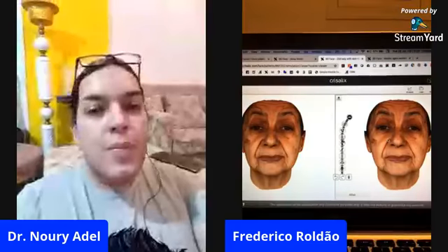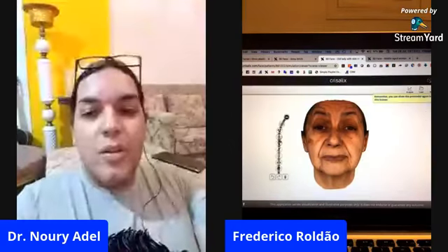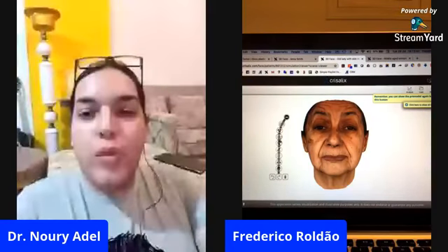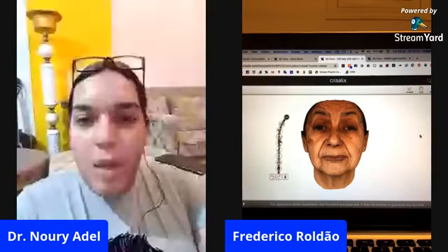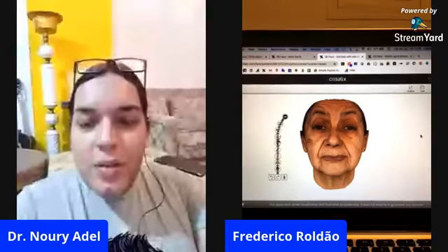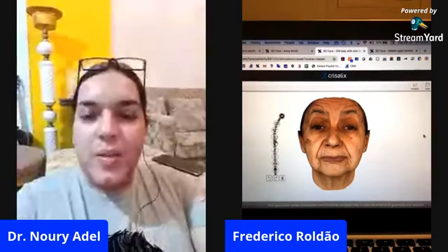Okay, so let me try to flip my camera here on my phone. And please tell me if you can see my screen. Can you see my screen? Yes, I can see it. I can see it very well. Okay, good. Could I ask you to move the laptop screen a little bit forward, because it's brighter at the bottom and it's starting to be a little bit darker up. It's darker on the top, you say? Yeah. So maybe if I adjust it, is this better? Yes, this is perfect. Okay, good.